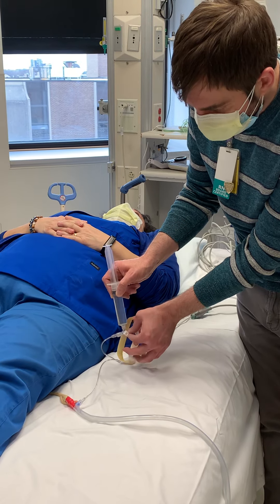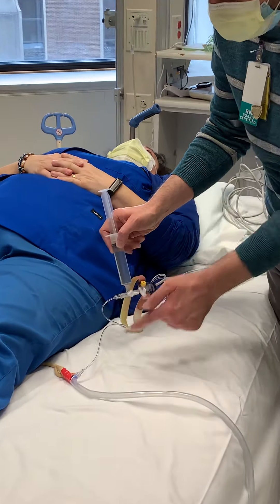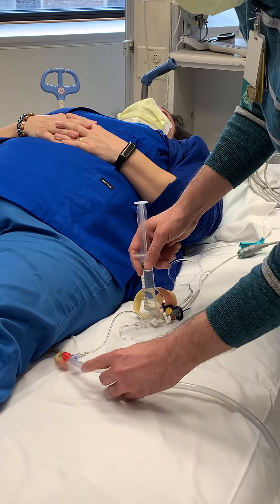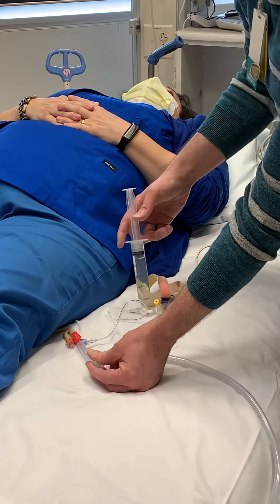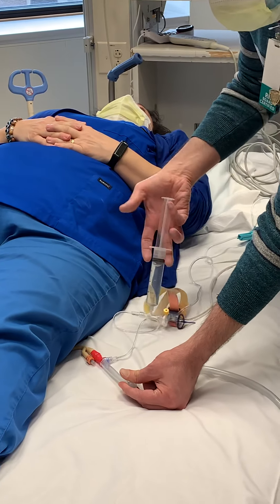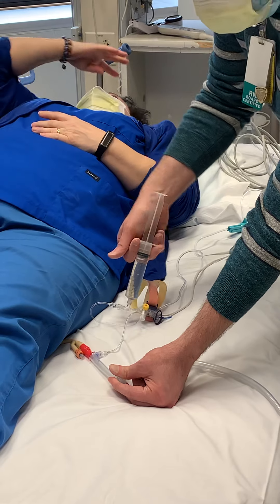Then you're going to turn your stopcock all the way back so that the syringe is communicating toward the patient. Then pinch the tubing off — we don't want the fluid to go back into the bag, we want it to go up into the bladder. Next, squirt all 25cc's of fluid in there.